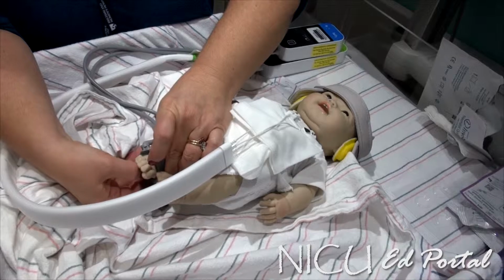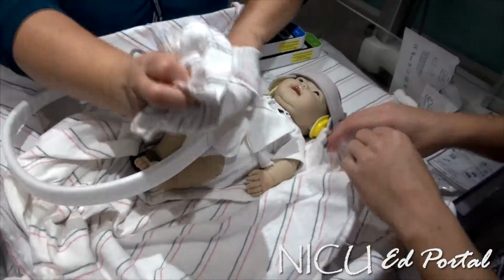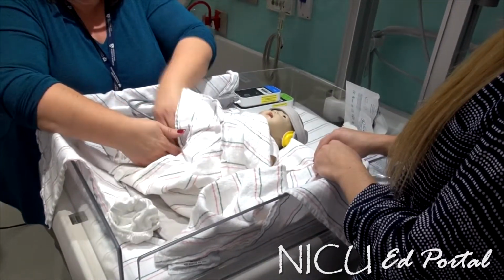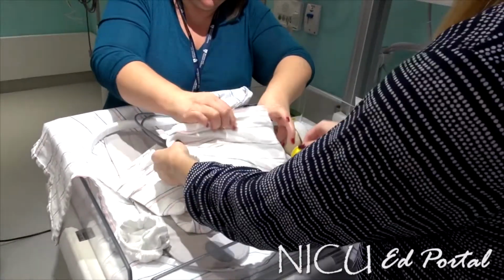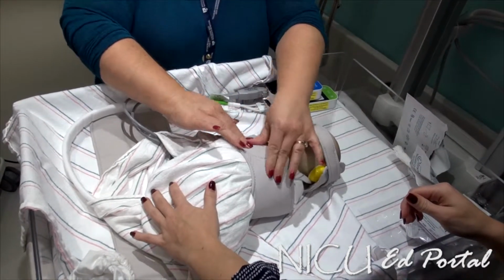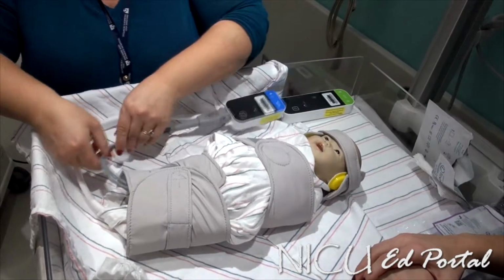One second, I just realized I did this wrong. He can be wrapped in his blanket, and then we're going to wrap him in this swaddle. Just want to make sure that these come down, and ideally, if we can possibly do it, we like to keep the foot out, because then we can get at it if it's not working. And then with this swaddle, the chest piece, unfortunately it's not usually this tight, but it's just because of the blanket and the fact that it's a doll. And then we're going to swaddle his legs, make sure they're down, and that will keep those still.